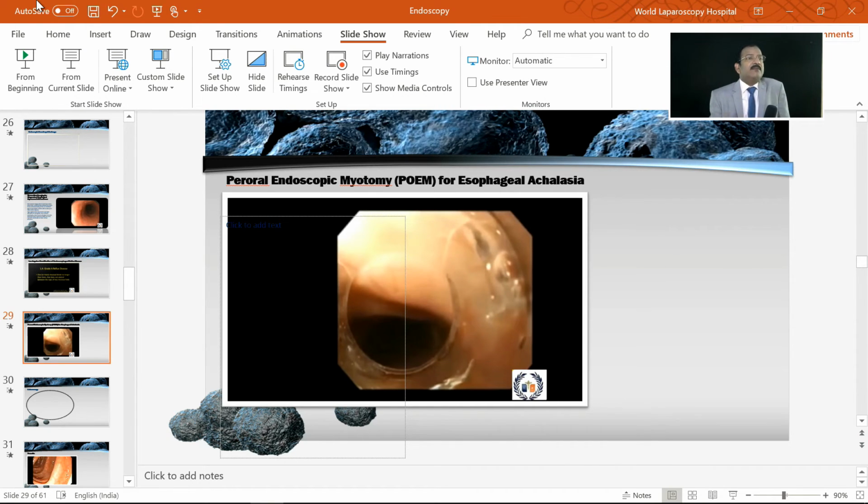So leak means connection of the air and fluid. That should not leak. Otherwise, it is leaking outside and you don't have an appropriate distension of the bubble, isn't it? And then you will struggle. So leak means this. And how to check the leak? Show the leak check now. In the fluid medium, just like the puncture tire test how we do, you see that bubbles should come out with a glass of water.